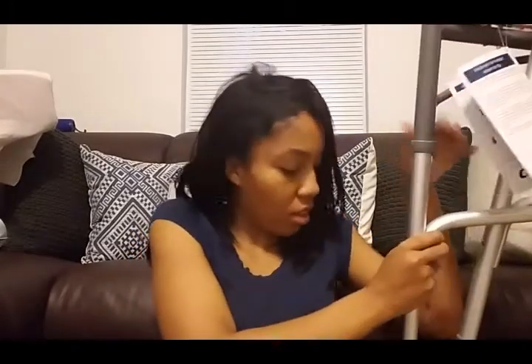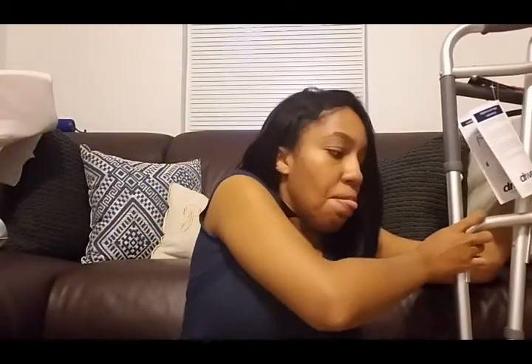So yeah, the next object that will help you guys out is, let's see if I can get this in the picture, tennis balls for the bottom of your walker. My first walker, for my first surgery, didn't have any wheels on it. So it was the most annoying, frustrating walker because I literally had to pick it up, put it down, pick it up, put it down for every step that I took.